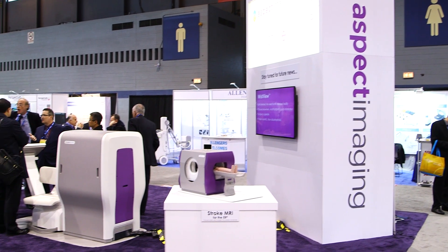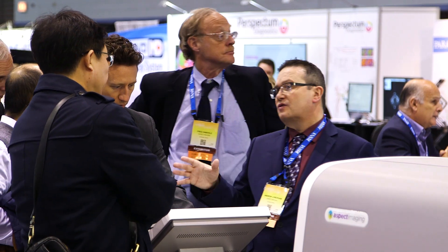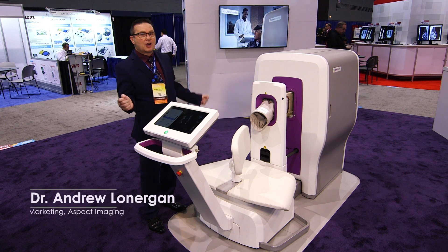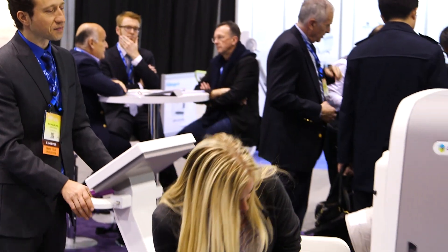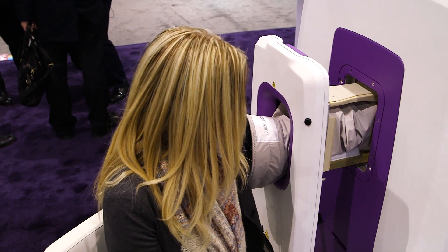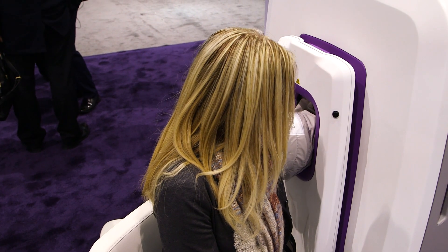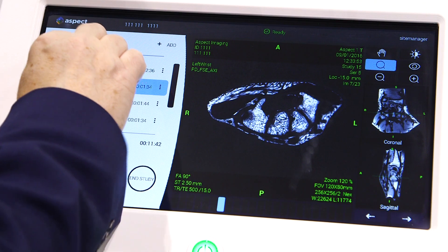I'd like to introduce the new Wrist View MRI system from Aspect. What's unique about this system is it requires no RF shielded room, and of course it's not claustrophobic. The patient can insert their right arm or left arm — we simply release the safety button and slide the patient into the system, and scanning can begin.